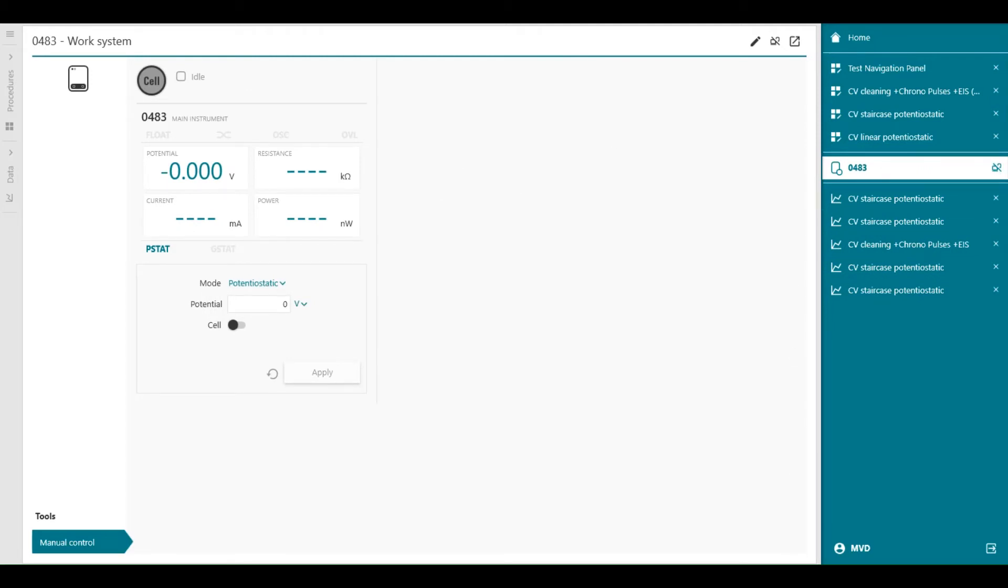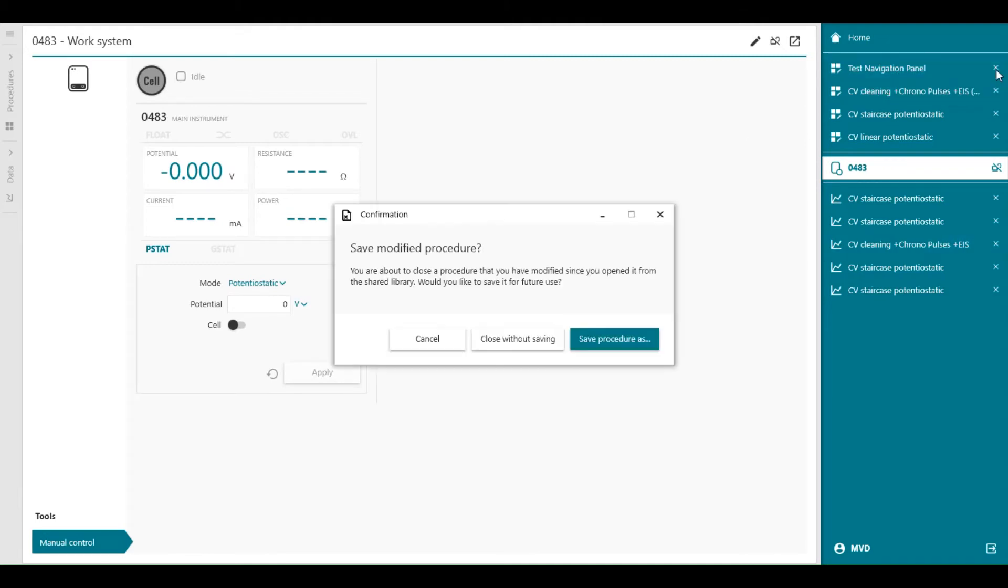To keep the navigation panel tidy, we can close procedures that are no longer needed using the X button. So for example, test navigation panel, I can close.